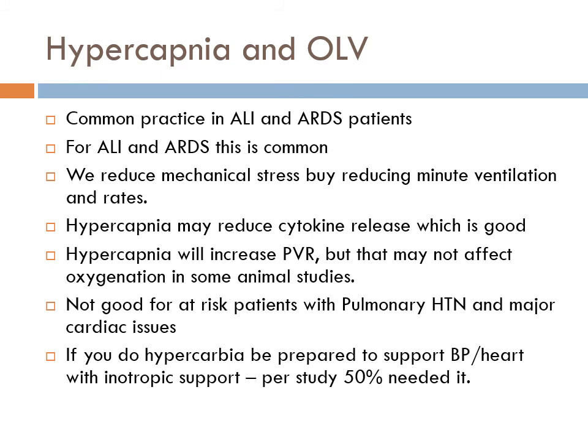Low tidal volumes are also good because that means there's going to be smaller movement of the lung fields, which might be helpful if you're not dropping a lung and you're operating on that side. That could be beneficial as well. Maybe you don't have to drop the lung at all. As you ventilate the dependent lung, that's still moving the thoracic cage, which could also interfere with the surgery on the non-dependent side if you're doing large tidal volumes.